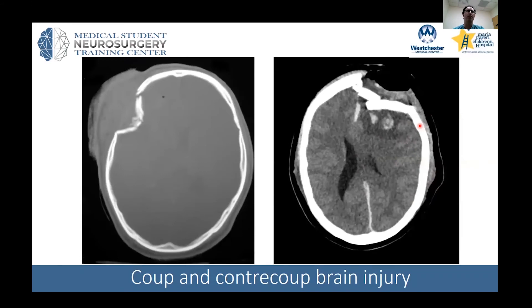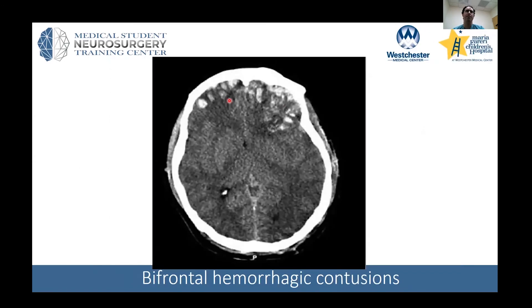Here's a much more significant example — a pretty severe depressed skull fracture. You can see the hematoma in the soft tissue above the skull, and below you see evidence of contusion or injury to the brain itself. Blood is usually bright on CT scans, as is the bone, so this case would require operative intervention.